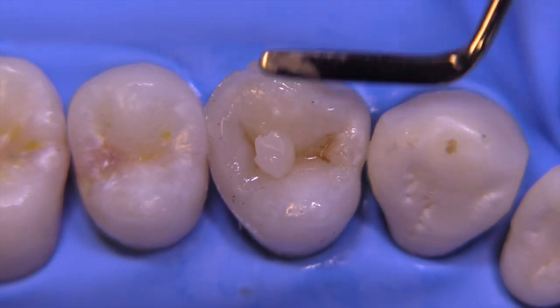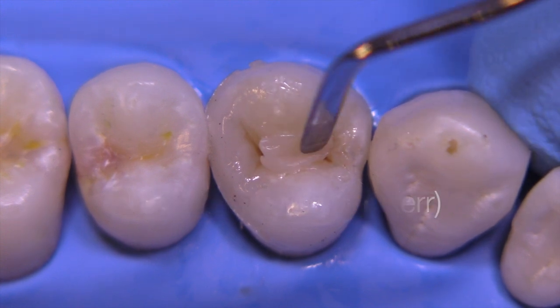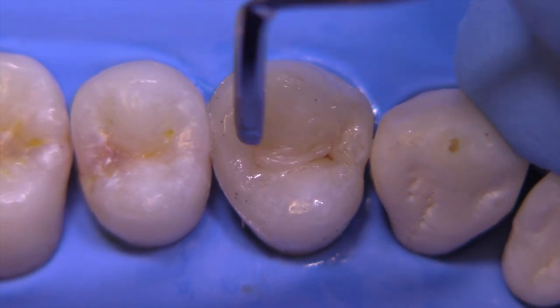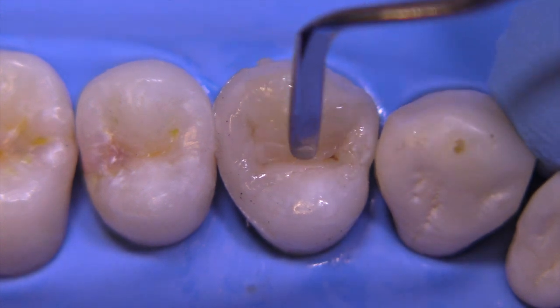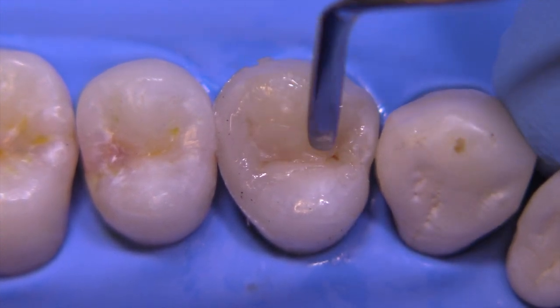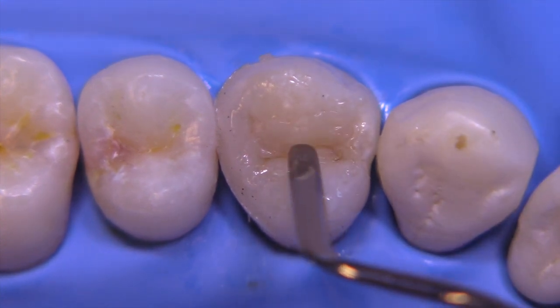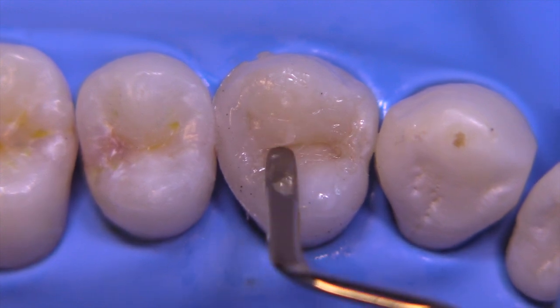Remember that this is still an under-contoured restoration. Now we're going to be placing a translucent composite meant to replicate enamel, and we're going to place this over the under-contoured dentin layer which has the stains in it. We continue to build these lobes so that they appear more natural.